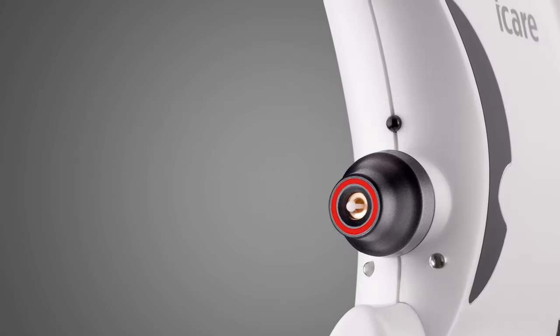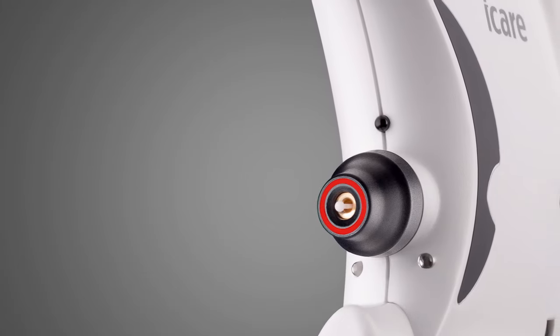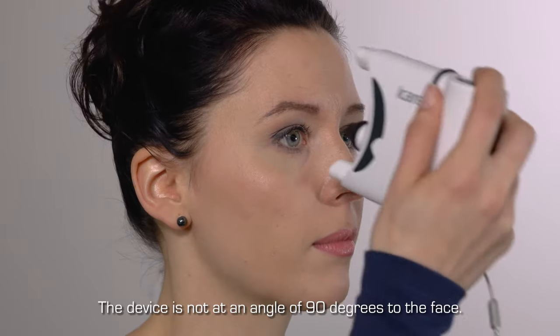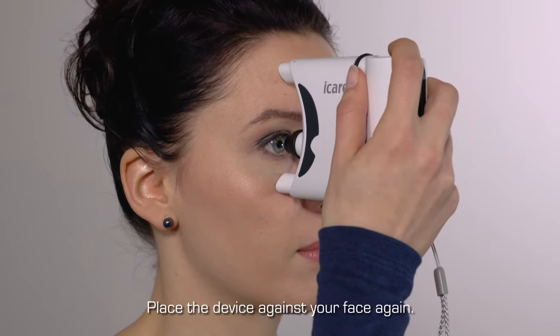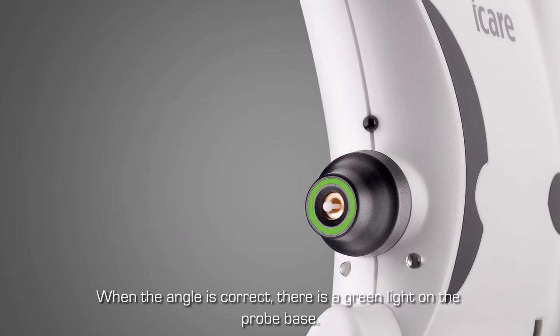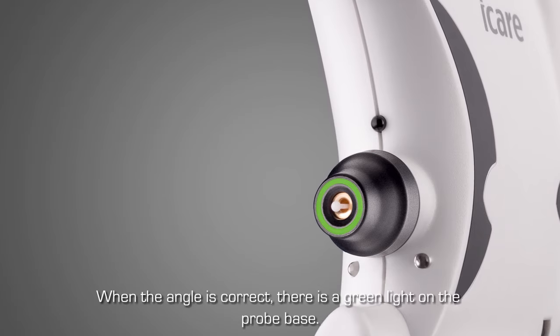Troubleshooting. If there is a red light in the probe base and the device will not measure, this indicates that the device is not at an angle of 90 degrees to the face. Reposition the tonometer against your face. When you find the correct angle, the probe base will glow green and a measurement can be made.